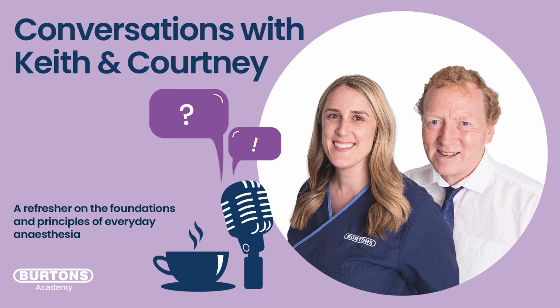And then there's the reflectance type, which has the emitter and the sensor on the same piece of material. So in other words, you've got a little square of material or plastic that holds the two, sensor and emitter, or it can be more longitudinal like the rectal types. Essentially, it sends out a light, and we'll only get that light back if it goes into tissue and sees something optically reflective, normally bone, ligament, or something like that, and that gets reflected back through the tissue again and picked up by the sensor next to the original emitter. So it goes in and comes back out again, hence the reflectance.